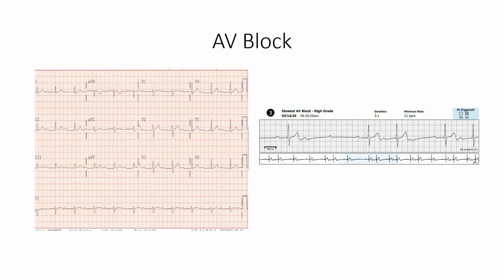But in any case, this got a little out of place, but this is a patient who I've followed for several years. At baseline, you can see he's in sinus rhythm, but has a very long first degree. This has been asymptomatic. It has been somewhat progressive in that the PR interval has lengthened over the years.